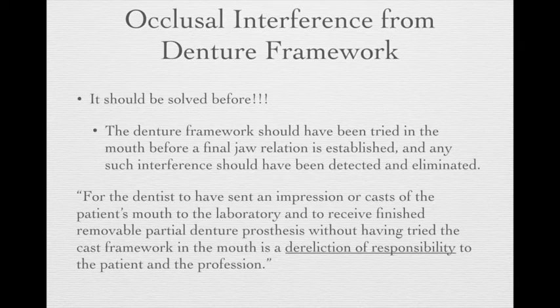After the adjustment of the denture-bearing area of the RPD, you will do occlusal adjustment. First of all, we should do occlusal adjustment to remove occlusal interference from the denture framework. However, most of the time we don't necessarily need to do this step at denture delivery, because it should be solved before. So when do we do this? We actually do this at the framework try-in.